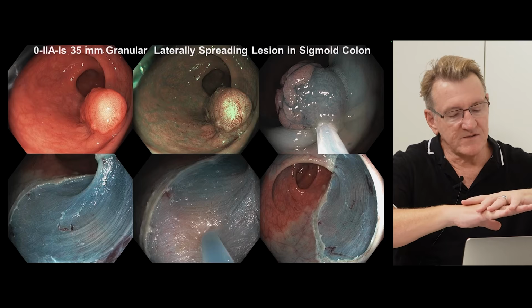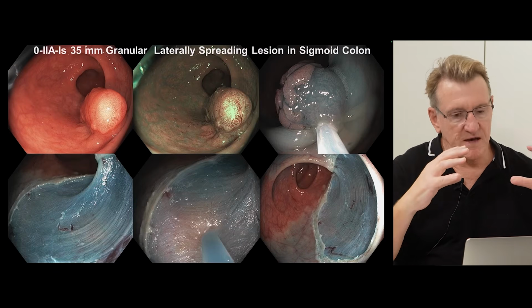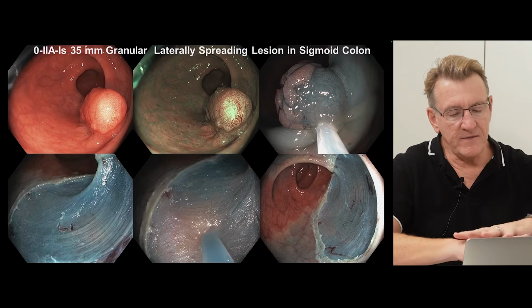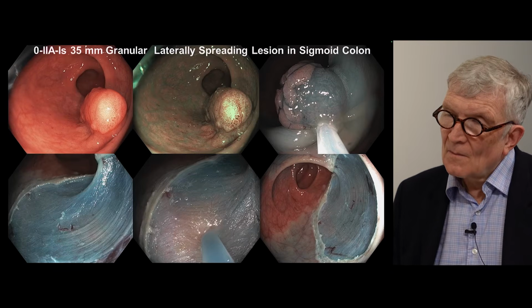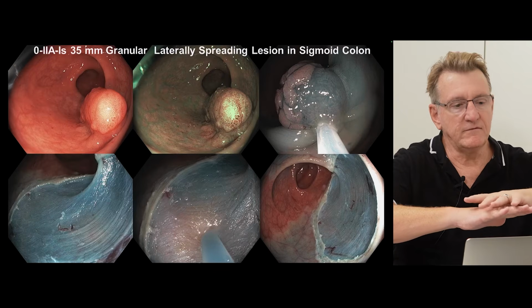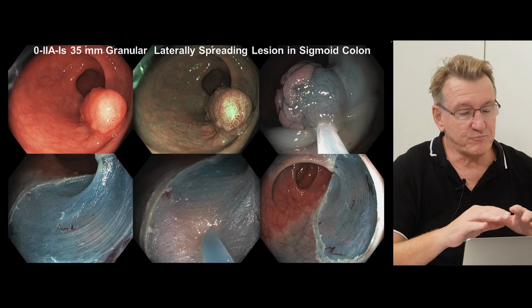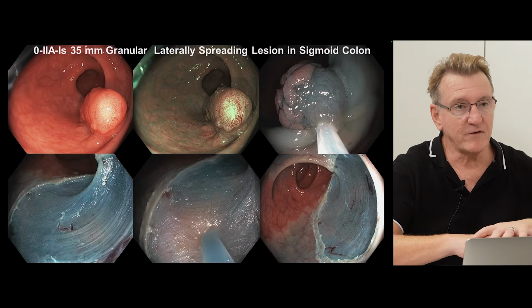When you make a submucosal injection, that potential space is expanded, and after the resection, it flattens out, and then you have these fibers that lie over the muscle. They're intersecting fibers, not parallel to each other, and they're avid for the blue dye indigo carmine. So it preferentially stains the submucosa, but it doesn't stain the muscle layer.